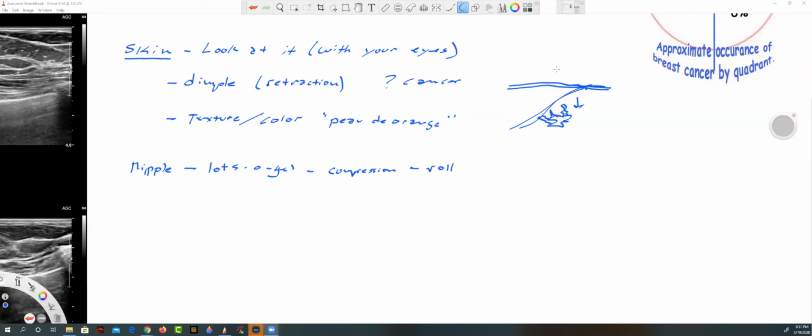One, when you're using the back of your hand, it's less likely to be interpreted as inappropriate touching. Also, you type with the front of your hand, not the back, so if you get gel on the back of your fingers, it's not such a big deal. Gloved hand, I would hold like this, get my transducer, and roll underneath the nipple. So that's one way of rolling the nipple.